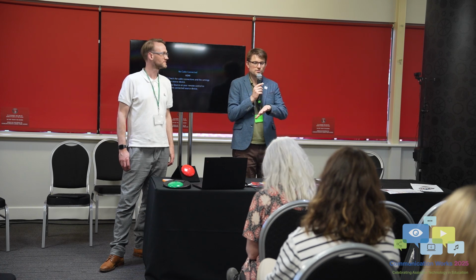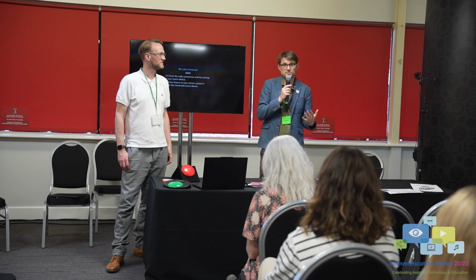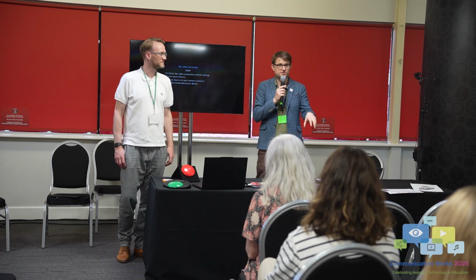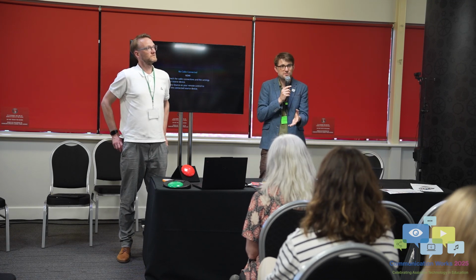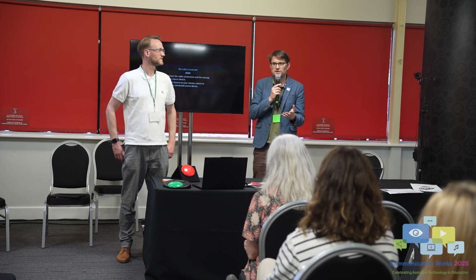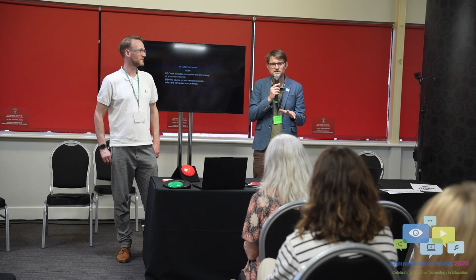I think we also promote having switches in different places and on different body parts for different things. If you've got switches that are out and about, it's a good idea to put symbols on them so that they can look at the symbol and know what the switch does, even more than the colour, depending on the person. It is a balance, and the classic statement: it depends on the individual.